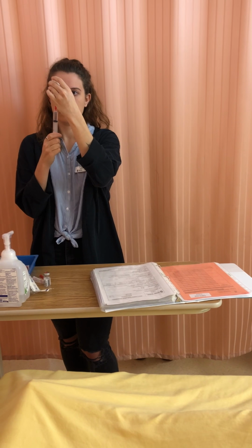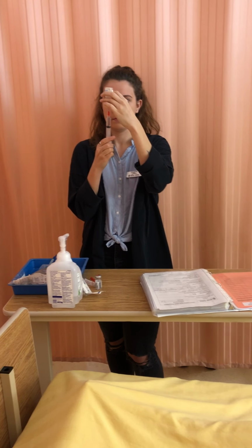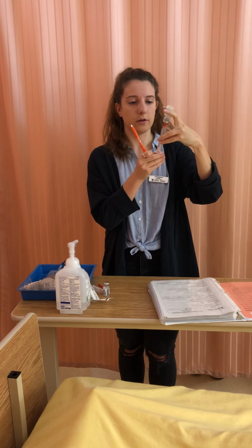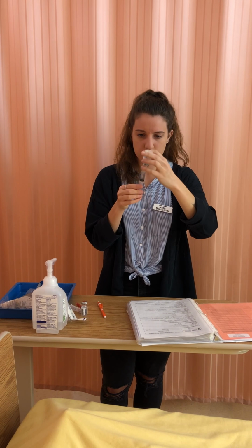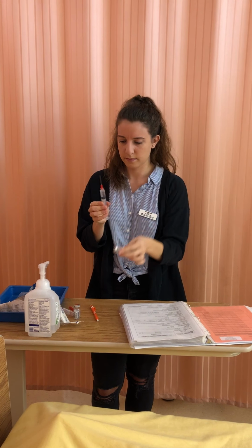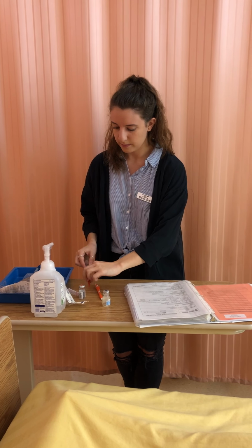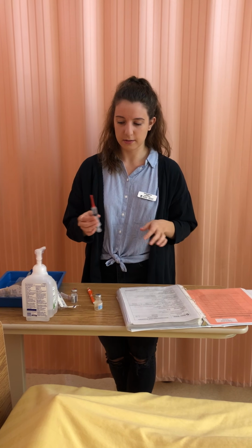So now I prepare my medication. I have a label here, and I'm going to attach this label. So I'm just going to get the bubbles out just to make sure that I do have the correct amount of sterile water in here. Be careful not to cover any information. Maintaining sterile technique, my needle did not touch the table. I'm ready to go to the patient's bedside.